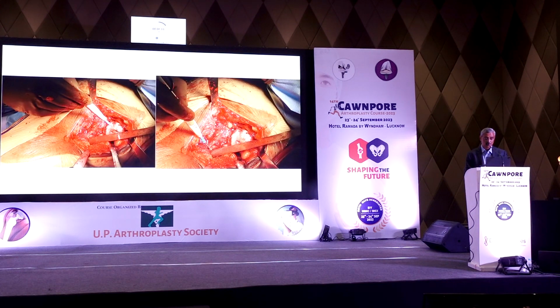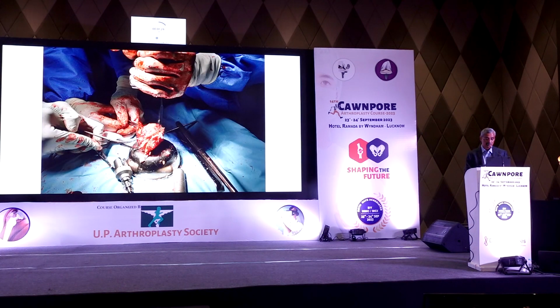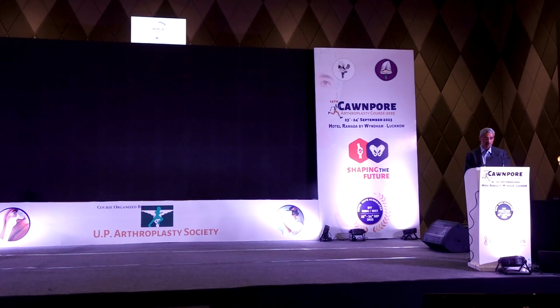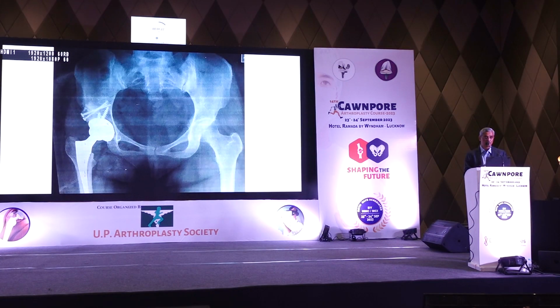You measure your offset, you do a very low neck resection, and then you plan to use the head for a bone graft. Wedges would be better. It incorporates better and lasts longer because some of these grafts can get resorbed. And of course, you need to delay weight bearing if you use a block graft like this. But you see, surprisingly, in this particular case, I could restore the offset. I could restore, in fact, probably I've lengthened the leg a bit.